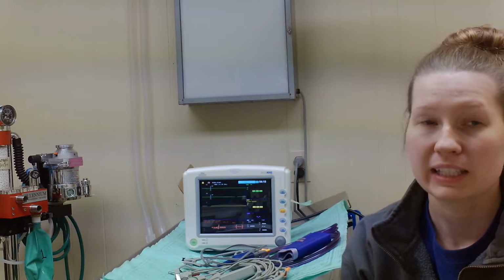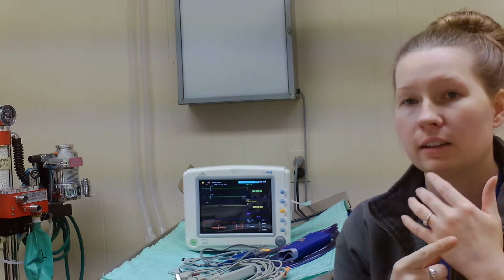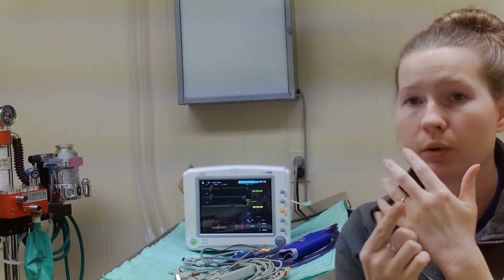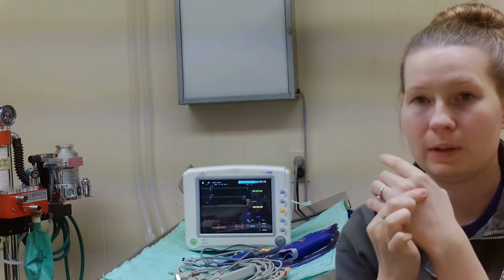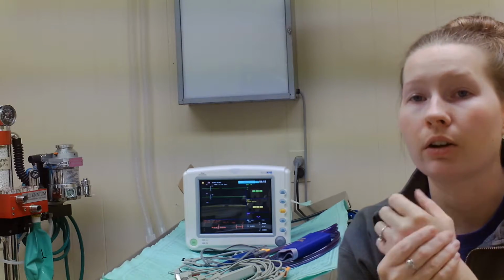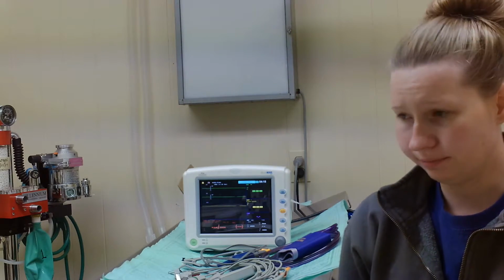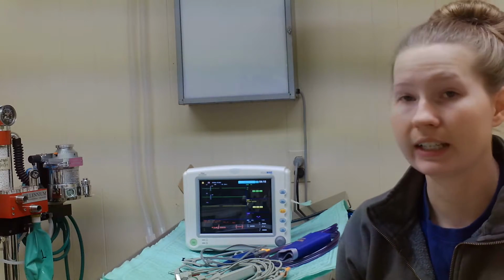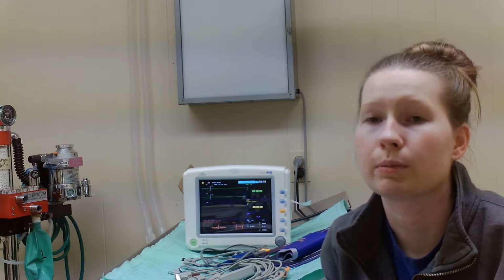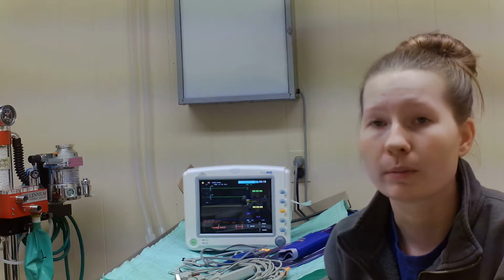Capillary refill time goes hand in hand with mucous membrane color. Essentially, you take your thumb or finger and press on the gum of the patient, and it'll blanch or whiten, and you count how long it takes for that blanching to go back to pink. If it's anything longer than 2 seconds, that means the patient's not able to perfuse their organs properly. If it's less than 2 seconds, that's normal, that's what we want.